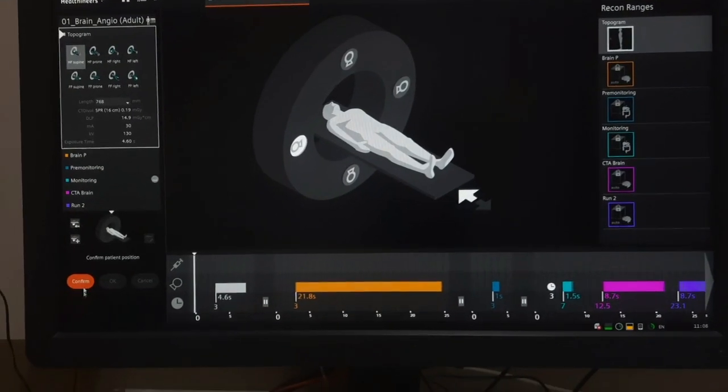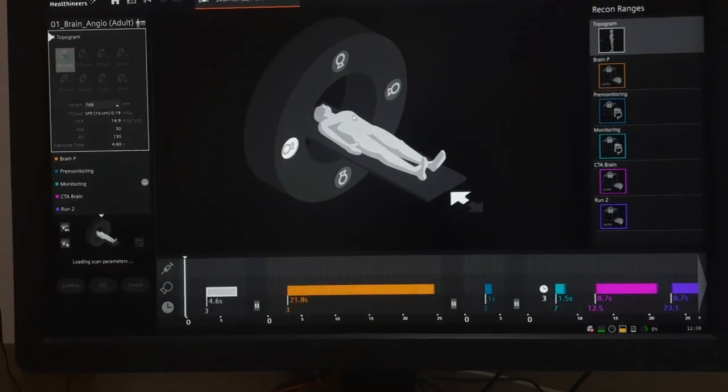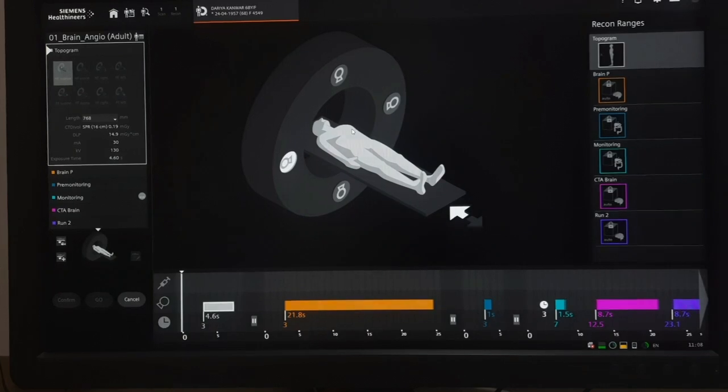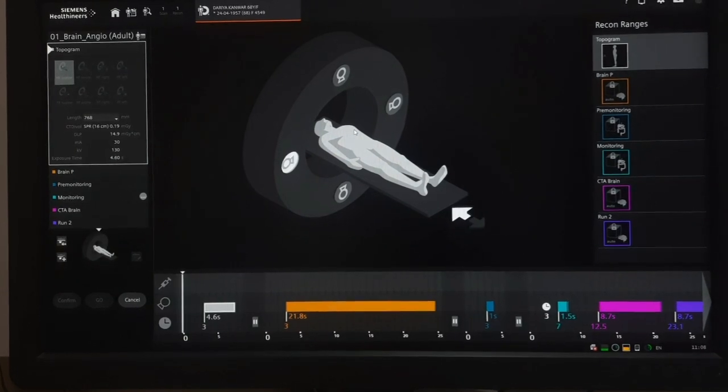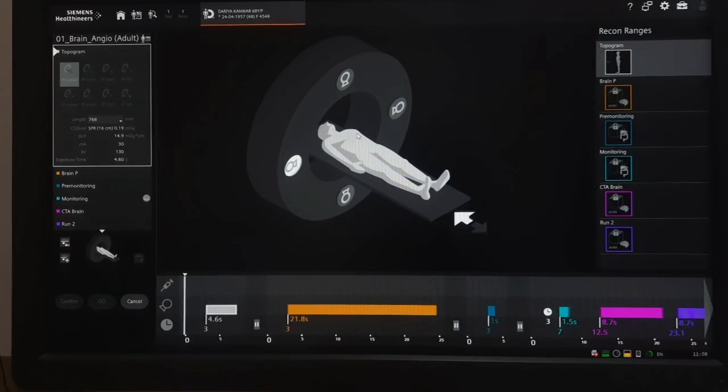Begin by confirming patient details and selecting the brain and neck CTA protocol. Once confirmed, press start.